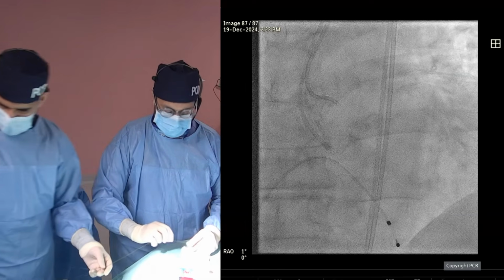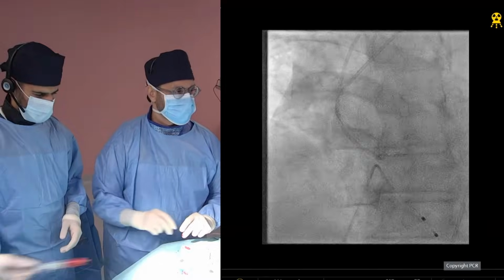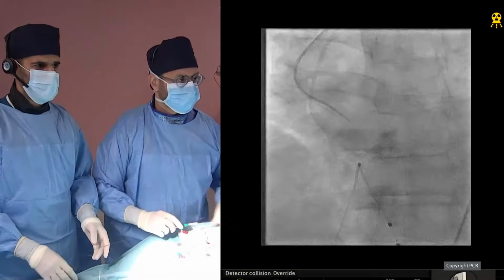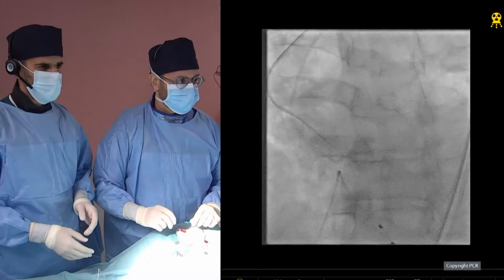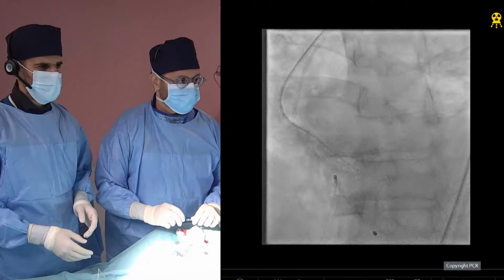While you're going to do this, and you did this in a coplanar view, what about the cusp overlap view for balloon expandable in this case, especially where you really want to be shallow to the membranous septum? How do you want to plan this?